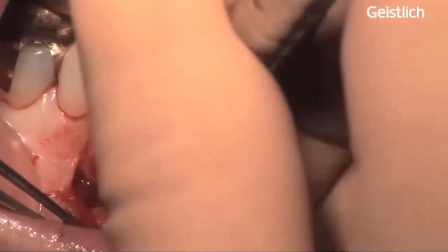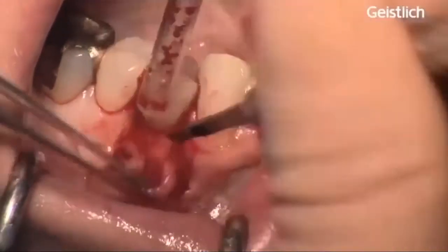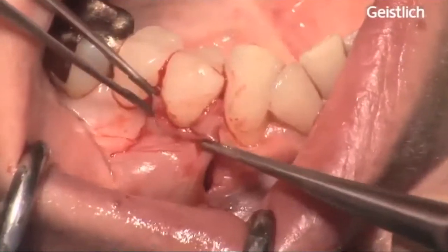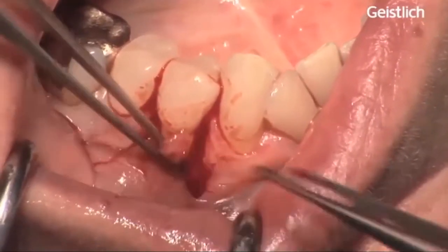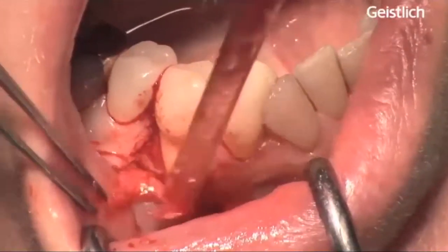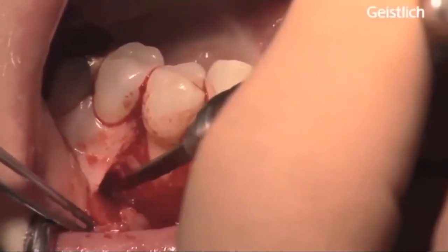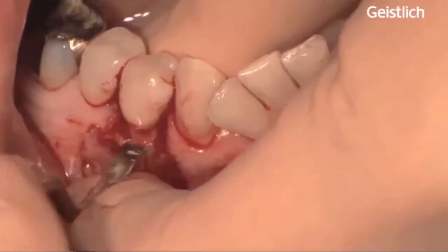Apical to the bone exposure, split thickness flap elevation is continued until it is possible to move the flap passively in the coronal direction. To permit the coronal advancement of the flap, all muscle insertions have to be eliminated. The blunt dissection is extended buccally and laterally to such an extent that the flap stays tension-free when positioned coronally to the level of the cemento-enamel junction.